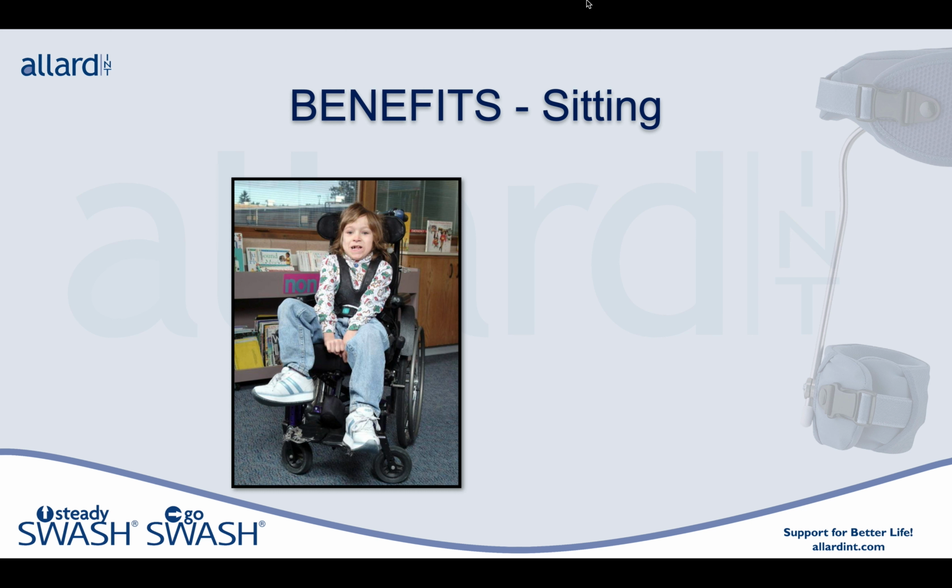With the introduction of the SWASH orthosis, we can see she's much more relaxed. You can eliminate the positioning straps, you can get rid of the pommel, and just look at the difference in her facial expression and how much happier she looks in her seating system. Again, this is primarily a non-ambulatory child.